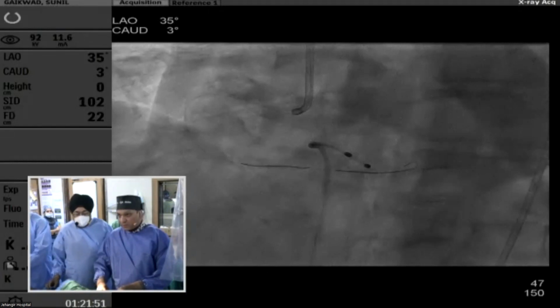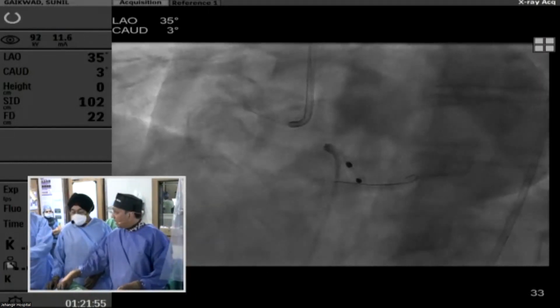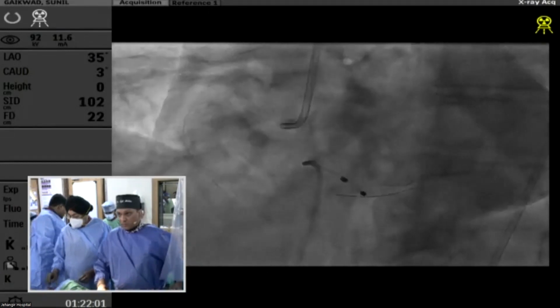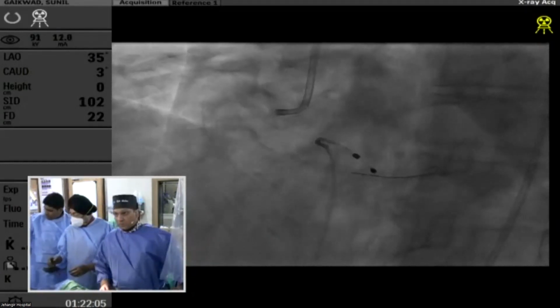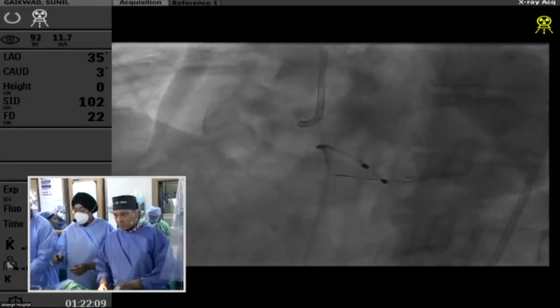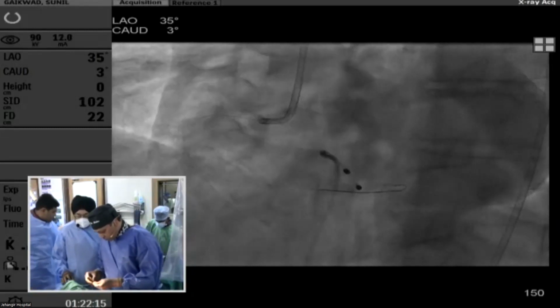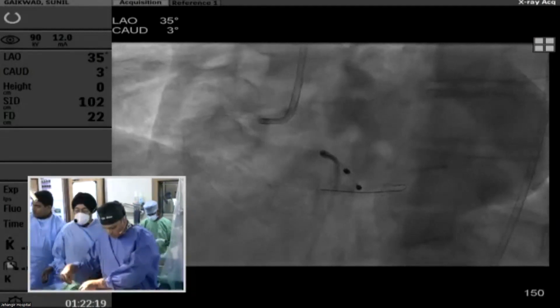By that time, can we ask the panel what different modification strategy anybody else would have used? Let me ask our panel what they're thinking. I think other than the thrombus in the RCA, what was the compelling reason to take up the patient so early for a procedure, unless he's having severe post-MI angina?